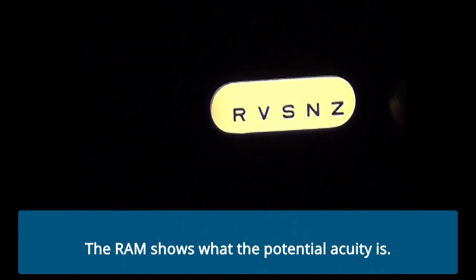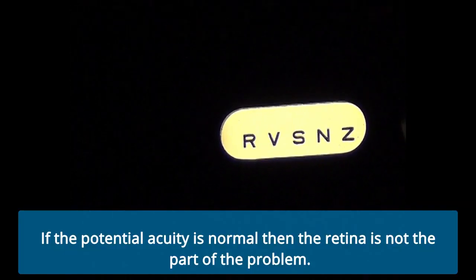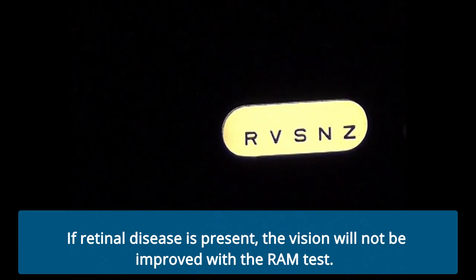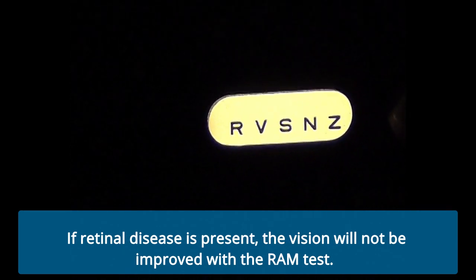The RAM shows what the potential acuity is. If the potential acuity is normal, then the retina is not part of the problem. If retinal disease is present, the vision will not be improved with the RAM test.